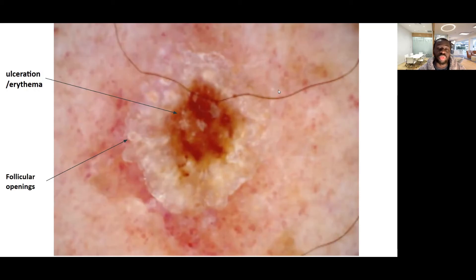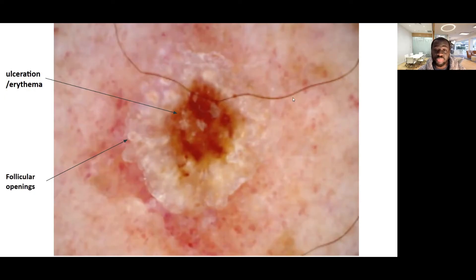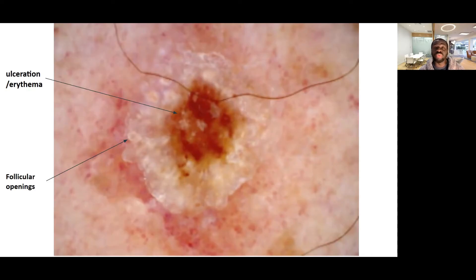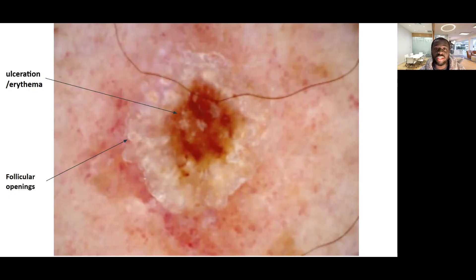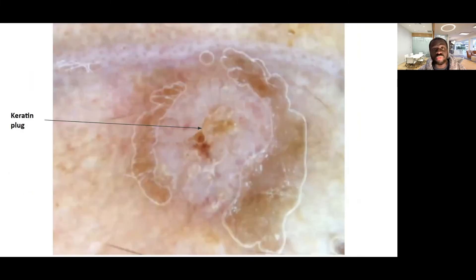Before you place your dermoscope on the lesion, for squamous cell carcinomas even without a dermoscope you should have a high index of suspicion. But this could be a squamous cell carcinoma, and dermoscopy is also useful. That's a typical keratin plug.